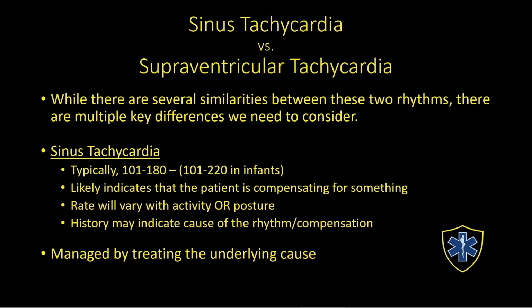It's not going to come down. Therefore, it's not the body trying to compensate for something. It's just the heart rate doing that on its own. On the other hand, if the rate varies from laying flat and it gets even faster when they sit up and even faster when they stand up, that would be an orthostatic change, which would be indicative that the body is actually compensating, therefore working harder and running the heart rate up higher when they're in a more upright position. That would lead us to believe it's sinus tach.